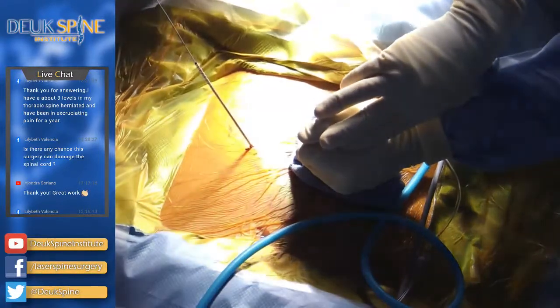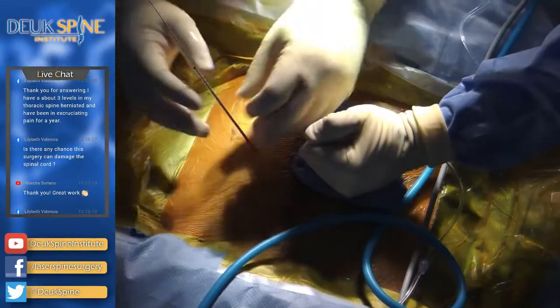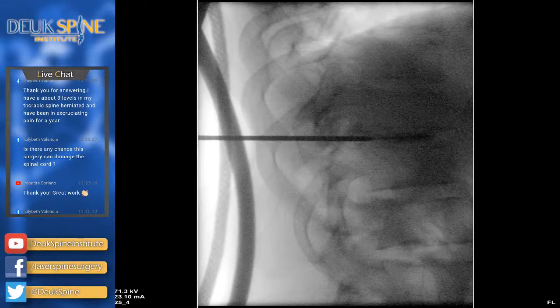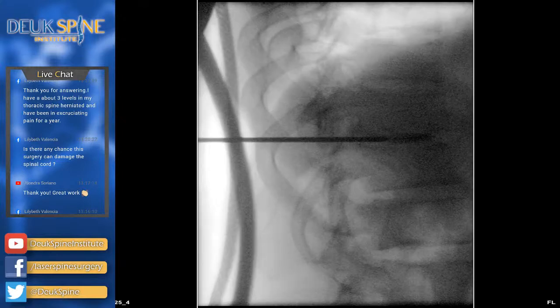Okay, shot. I feel the herniation. We're right on it. I'm going to try to push the herniation back into the disc as I did on the other side, gently and very carefully to get it reduced. It's called a reduction. I'm not talking about reducing a sauce like a saucier would. We're talking about reducing something that's sticking out of place. And in surgery, we call that a reduction. Shot. All right, that's looking pretty good.